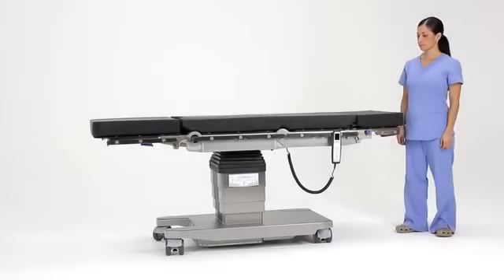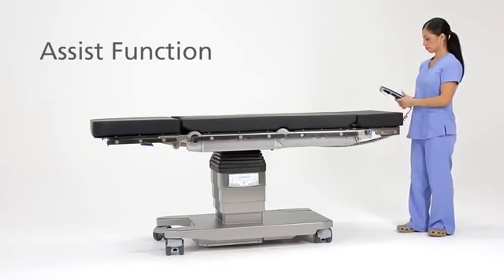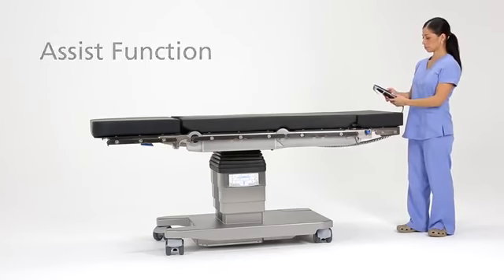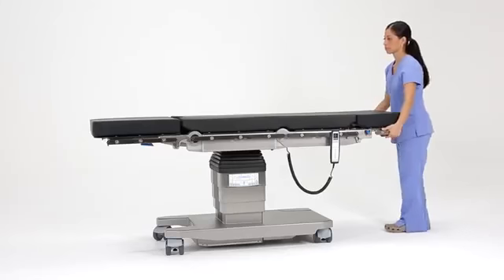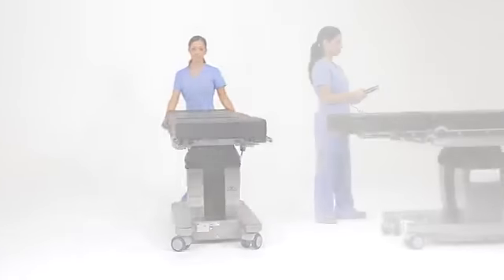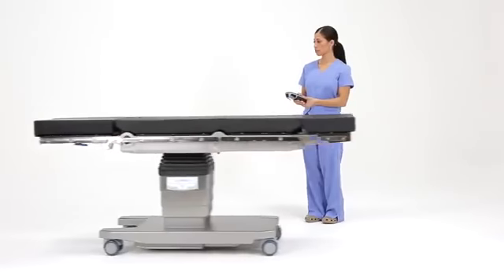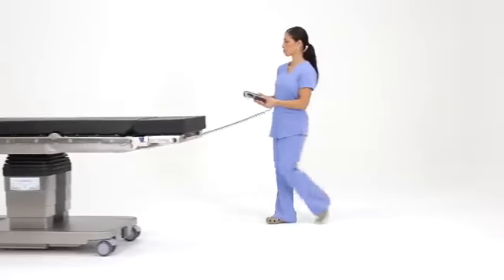The TruSystem 7000's unique fifth wheel increases mobility by enabling the clinician to easily maneuver the table safely while transporting it inside and outside of the OR. It also allows surgical team members to easily rotate and reorient the table for certain procedures. As an optional feature, the fifth wheel can be self-propelled, allowing you to effortlessly drive the table throughout the hospital.